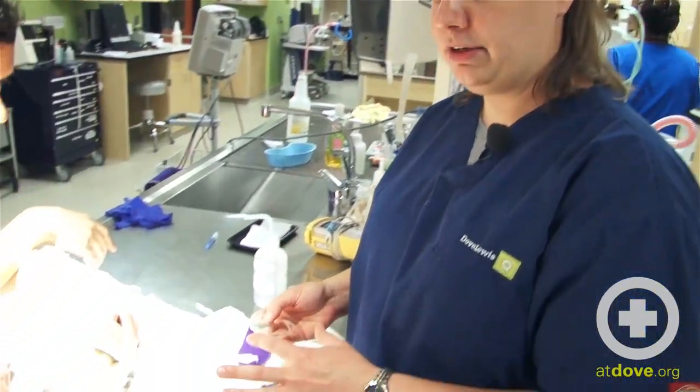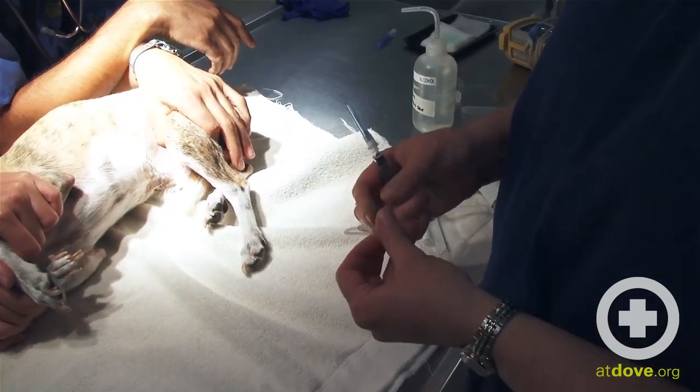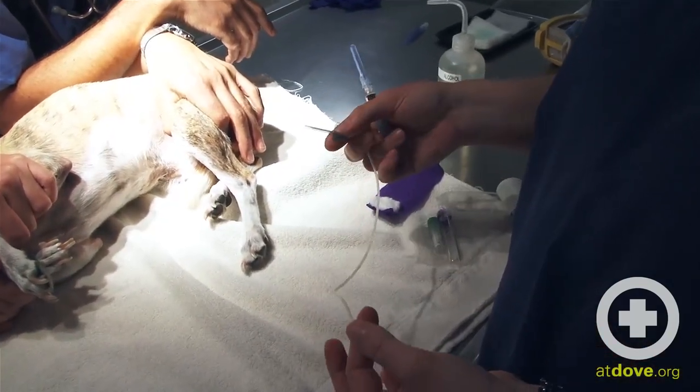Hi, I'm Megan. Today we're going to perform a blood draw from a lateral saphenous vein and I'm going to use a butterfly catheter. I like to use butterfly catheters on smaller patients. The tendency to collapse the vein with a larger syringe is not there with a butterfly catheter.